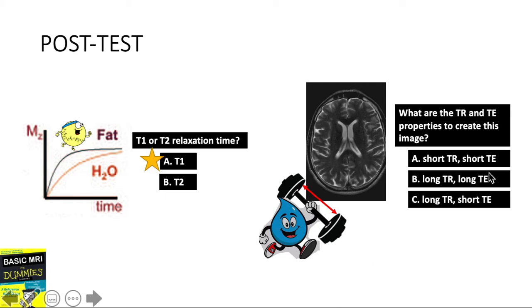Question 2: this image shows what TR and TE properties are needed to create this image? First, what type of image is this? This is a T2 weighted sequence, so T2 weighted sequence highlights the long TE property of water. This is created by long TR and long TE property.